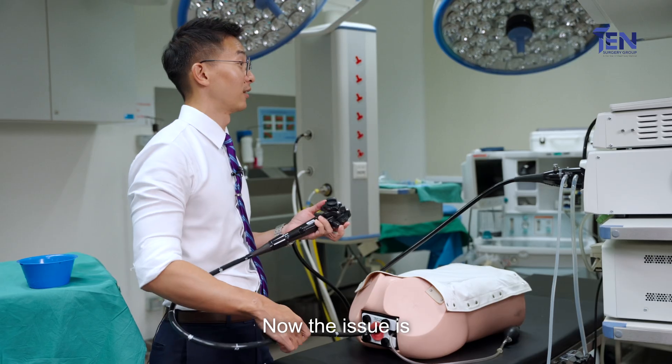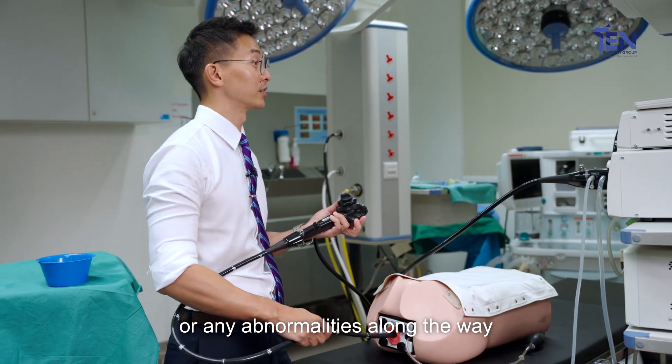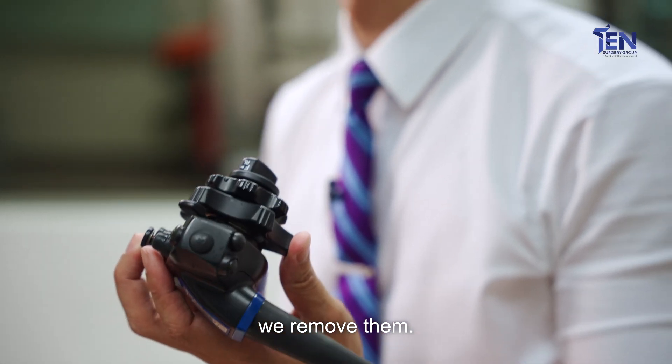Now we've reached the end of the colon. The issue is we have to look for any polyps or any abnormalities along the way, and at the same time, if we do see them, we remove them.